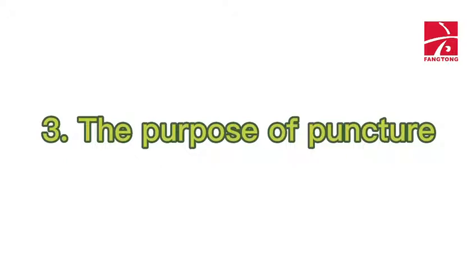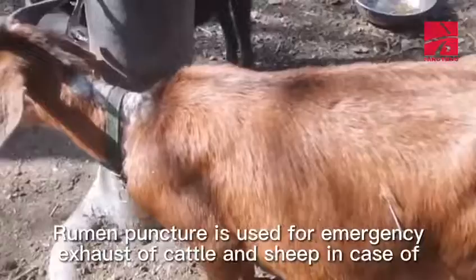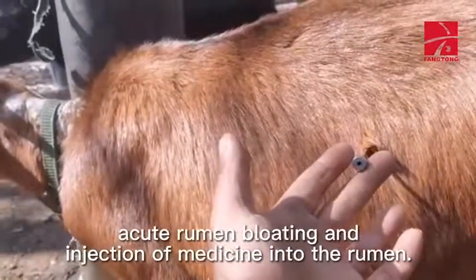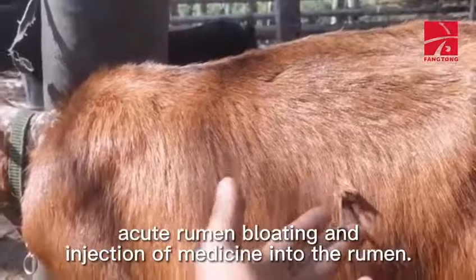Third, the purpose of puncture: rumen puncture is used for emergency exhaust of cattle and sheep in case of acute rumen bloating, and for injection of medicine into the rumen.